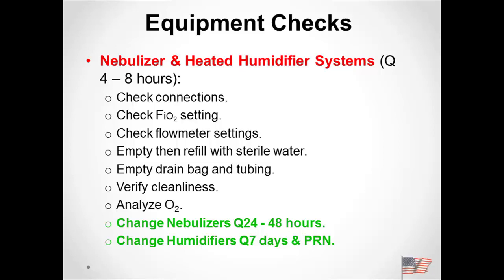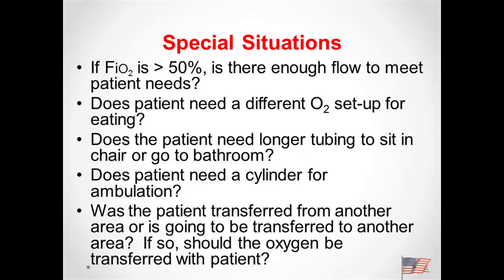Make sure the drain bag is at the lowest point in the circuit, and then we can drain it. And again, if the patient is on greater than 50%, can the device meet or exceed the patient's needs?